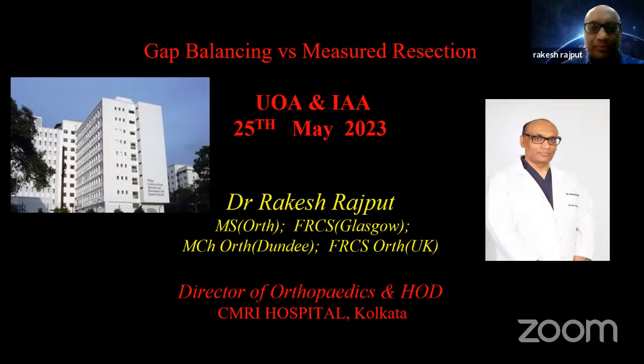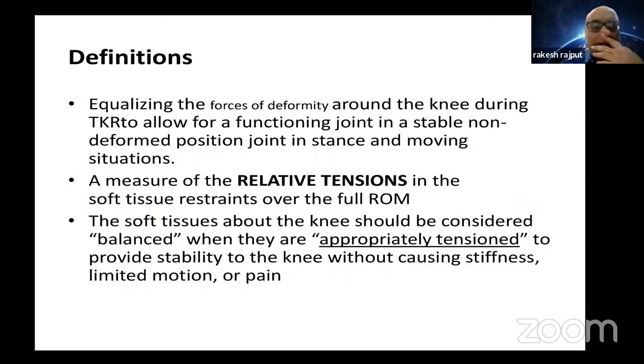So I think the talk which was given to me was gap balancing and measured resection. I think what you saw, Dr. Rajeev, showing all these techniques was basically about measured resection. But there is something more which has come more and more into vogue now, which is called the gap balancing technique. So we'll just go through from that.